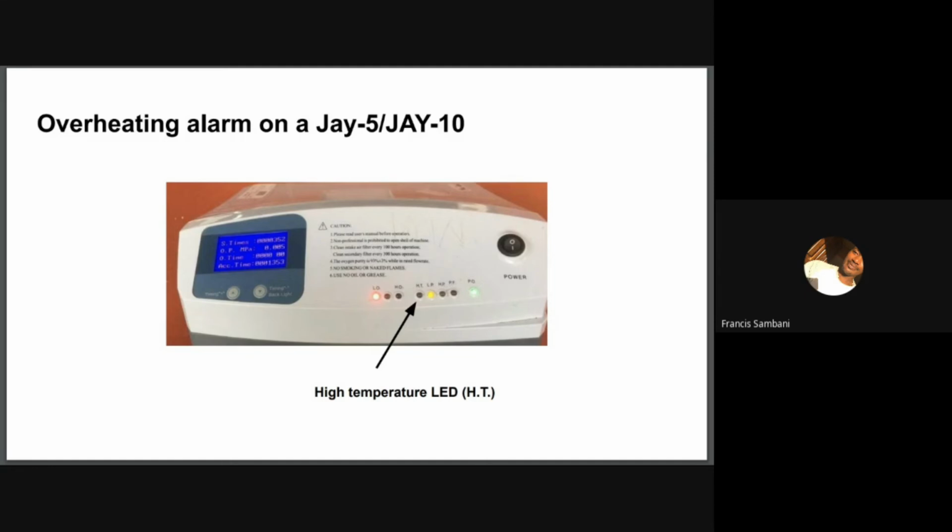So, and also the oxygen concentrator will stop running. It is also worth saying that the compressor windings have a thermal safety. You won't find the thermofuse as in the Airsep model, where you can easily see it. But in the J5, the compressor windings have a thermal safety, which is ensured by a thermal switch situated in the motor windings themselves. And this thermal switch is rated at 145 degrees Celsius plus or minus 5 degrees Celsius.